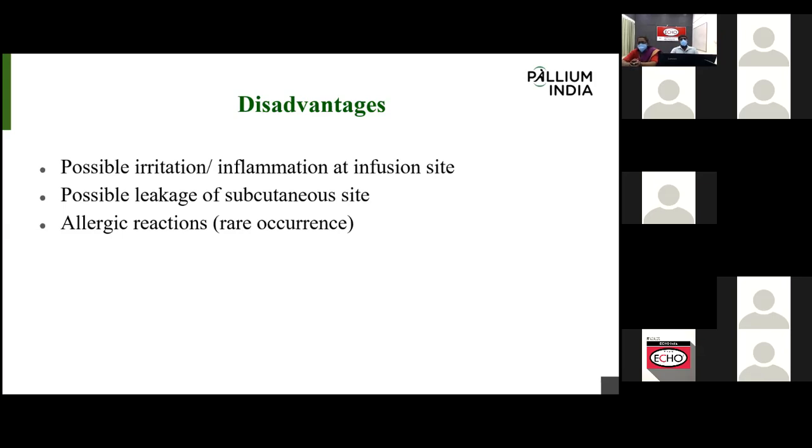Then, if the patient has an allergic reaction, for example to the occlusive dressing or adhesive tape, that material is allergic for some patients. In such a situation, that is also very rare. An allergic reaction may be caused by using these accessory items.